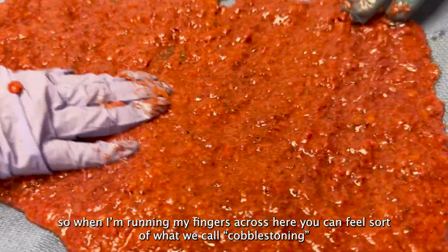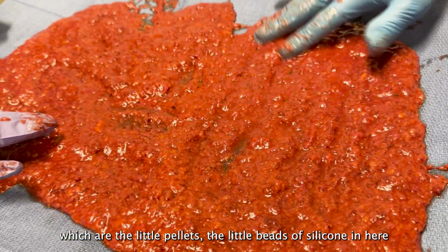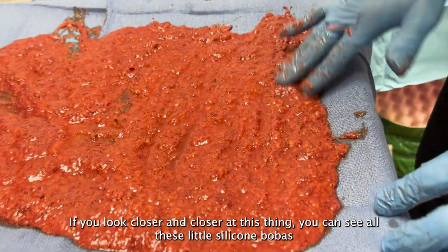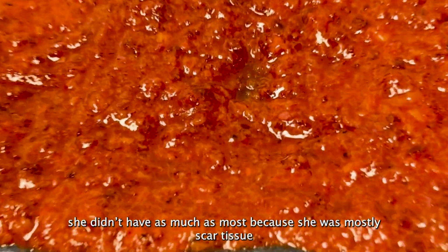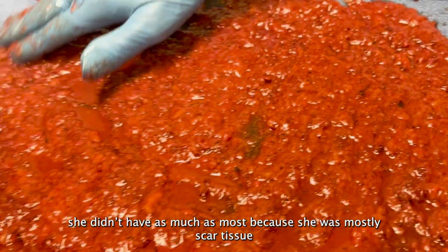So when I'm running my fingers across here, you can feel this, what we call cobblestoning, which are the little pellets, the little beads of silicone here. So as you look closer and closer at this thing, you can see all these little silicone bobas, these little balls of silicone. She didn't have as much as most, because she was mostly scar tissue.